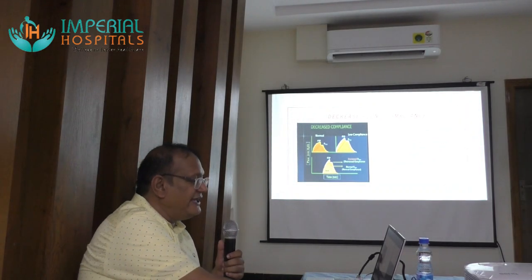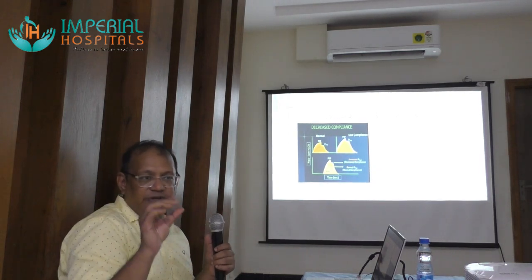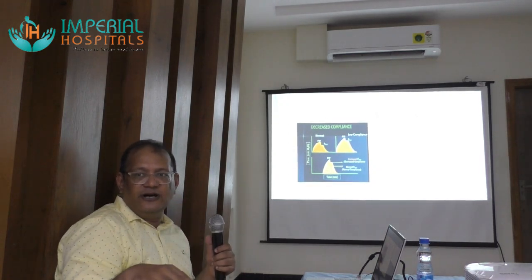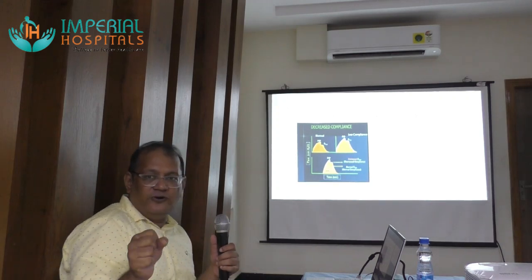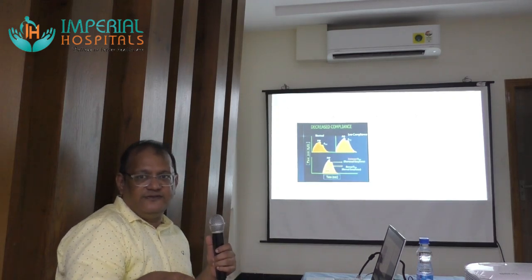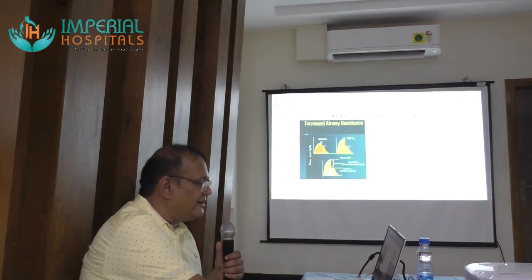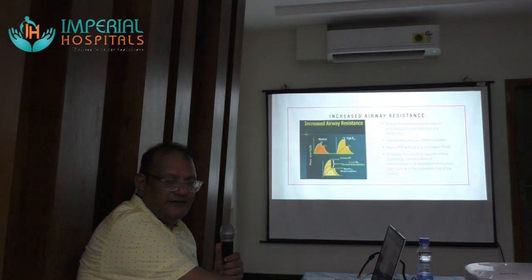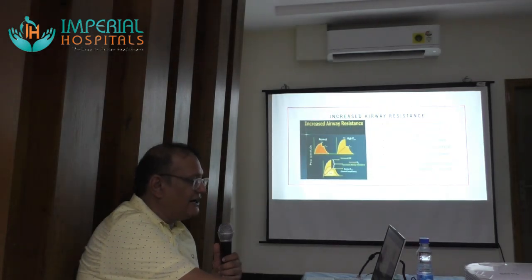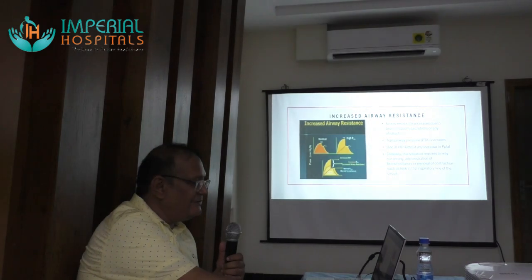But if you see airway resistance has increased, right? Airway resistance can be increased either due to kinking of the tubes, or due to accumulation of fluid in the tubings, or bronchospasm. So it could be any of those. In cases where you see a sudden increase of the airway resistance, you can treat those conditions: administer bronchodilators, remove the kink, or do suctioning. It will be useful there.